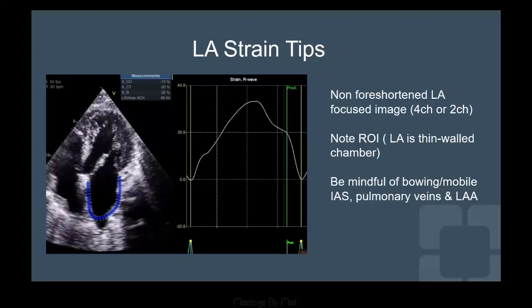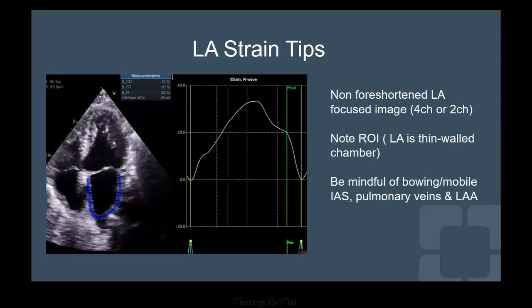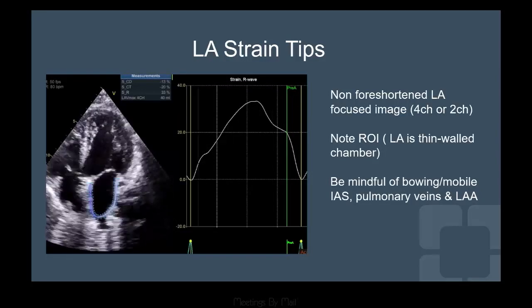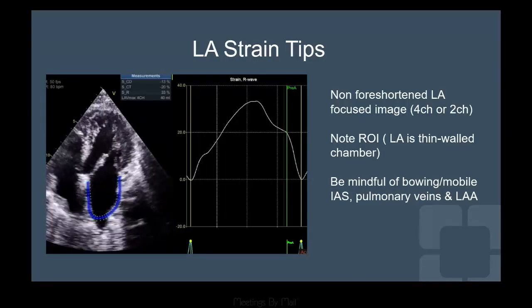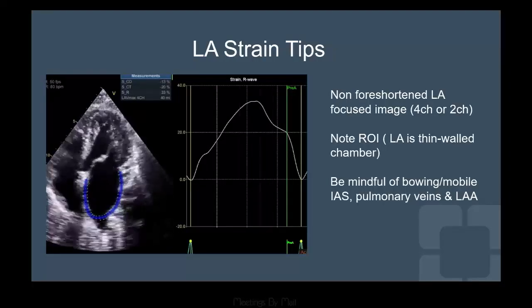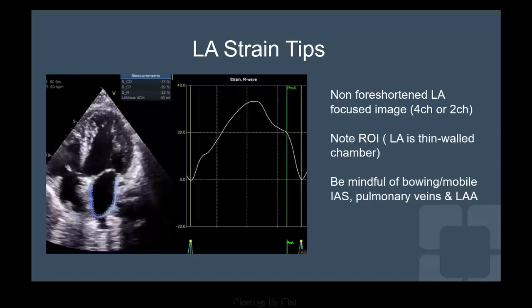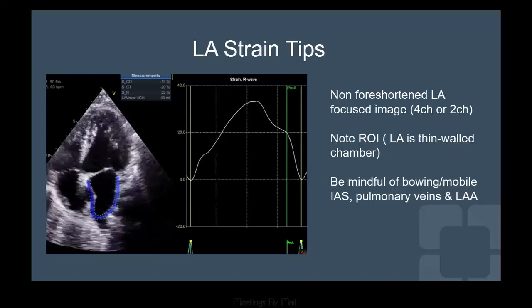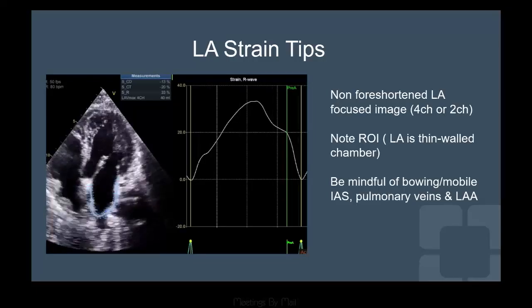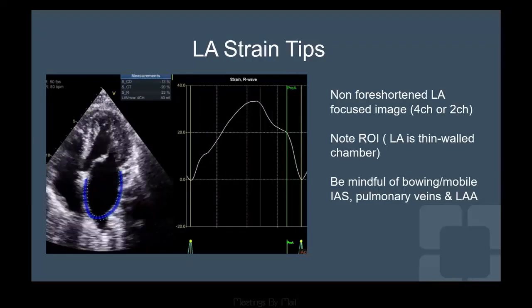If you just do one beat, it is not going to be reliable, because it's very dependent on the RR interval. For that sake, I don't know how much AFib we do atrial strain, but I think typically we like to do it only when it is reproducible, like in sinus rhythm. I don't know whether you do it in AFib. AFib would make it more difficult, but just to anybody in academics, if you write a paper on LA strain in any disease, it's going to get published.